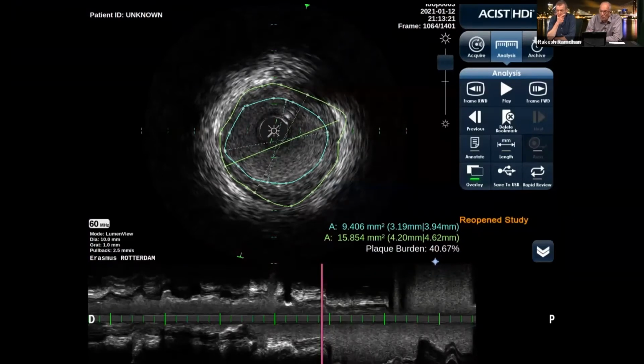And for the mid, I have said for many years: please size on your lumen. Forget a bit the media, especially in here. If we have 40%, then some old studies, even from before IVUS, from Mr. Glagov, and later by Hermiller, who demonstrated the remodeling with IVUS, showed that below 50%, especially with 40%, your vessel size is first increasing or stays the same.